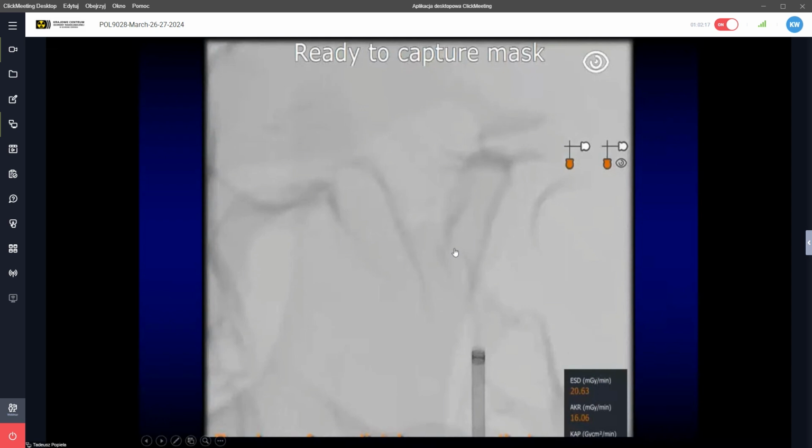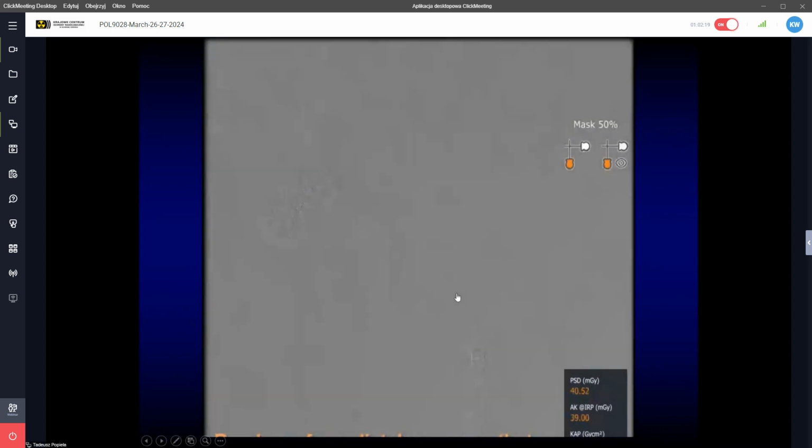And then you see that we can perform something we love. It really is the so-called roadmap. The roadmap is the sequence which allows us in real time to navigate with the guide wire and catheter. We are doing it based on the fluoroscopy. So we push the button with fluoroscopy, then we inject the contrast, and we are waiting for the best opacification of the vessel, and in this case the aneurysm. If we see there is the best time, we turn off the fluoroscopy, and then the last image is frozen, is stopped on the live monitor.